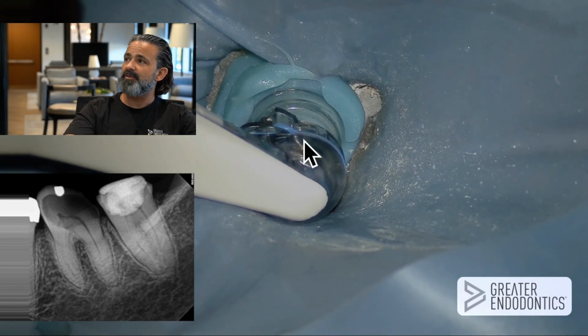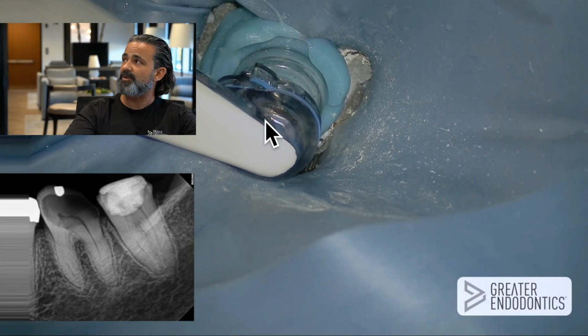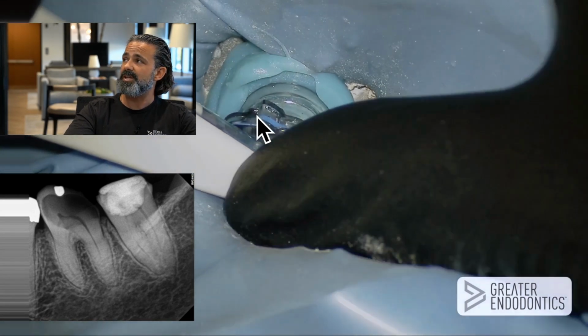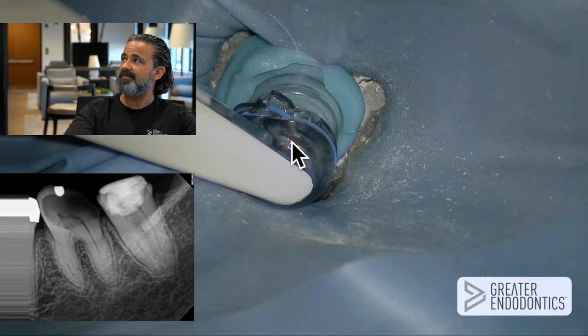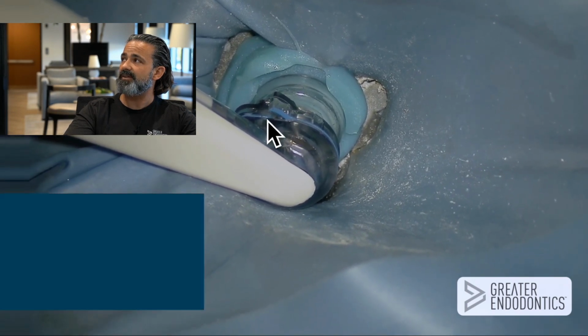And not through the center, but around the little exhaust tunnels that go around the sound bar is where we're really paying close attention, and making sure that's fully seated. And we're going to go through the degassing phase right now. I'm watching these bubbles. This is the little exhaust vent right here.